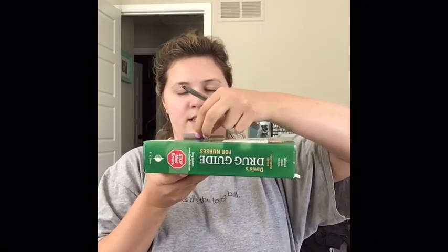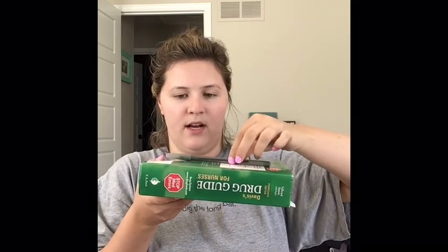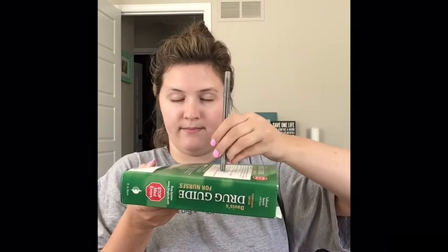I'm going to try. Okay, so let's say this is my needle here, and this is my cap. I'm going to do a one-handed kind of thing. I'm just going to scoop it up in there and then put it back on, basically. It's just a one-handed scoop.